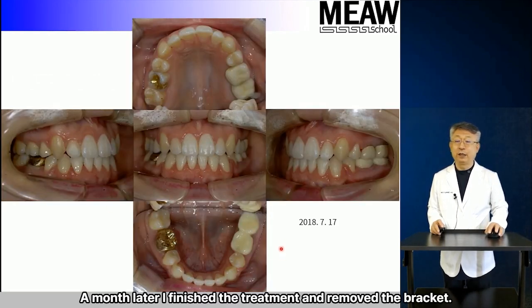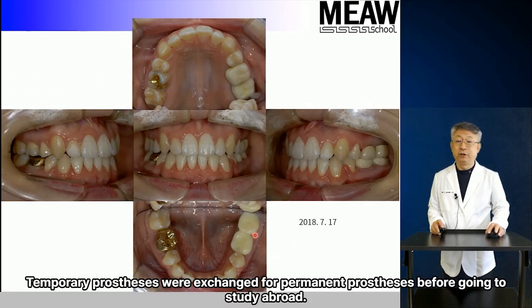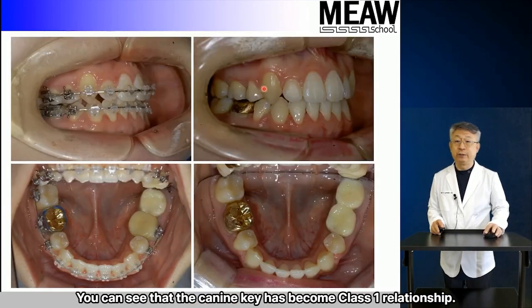A month later, I finished the treatment and removed the bracket. What have I been doing in the month? Temporary prostheses were exchanged for permanent prostheses before going to study abroad. You can see that the canine key has become class 1 relationship.